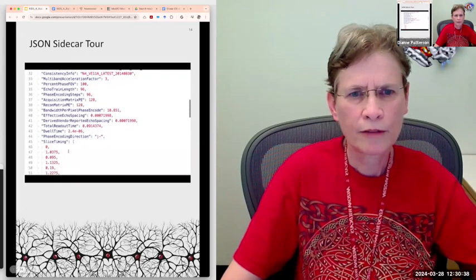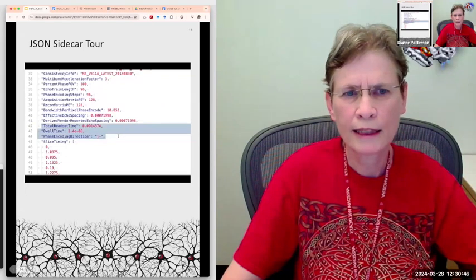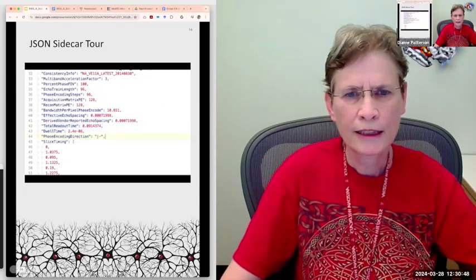And the metadata required for processing that I keep harping on. There it is, effective echo spacing, total readout time, dwell time, right there forever in your data set for anybody to use, and any program to use.